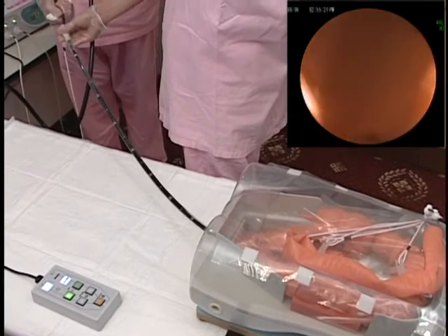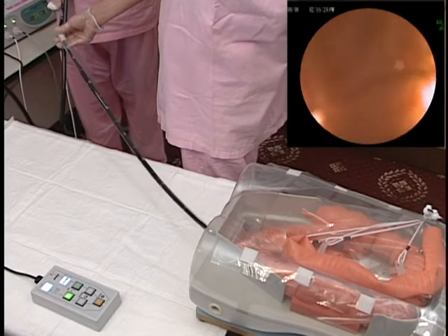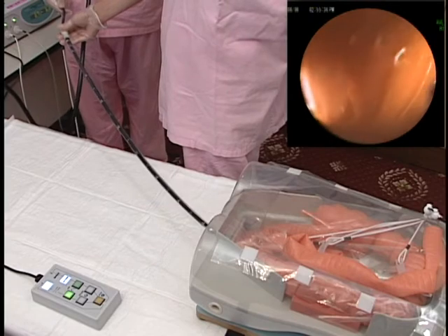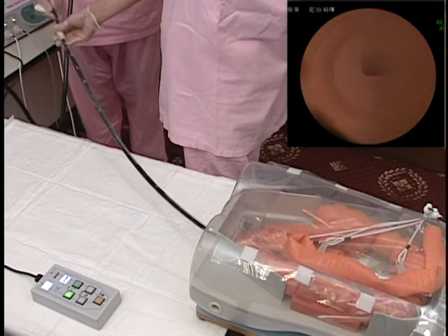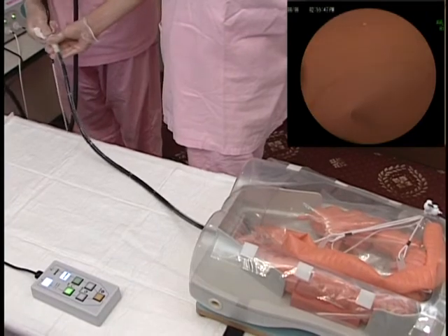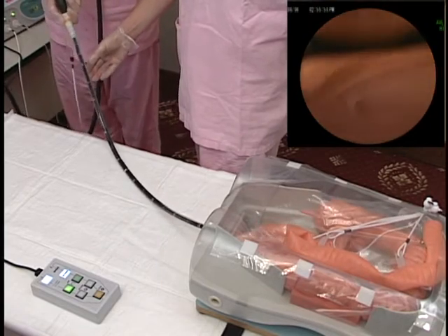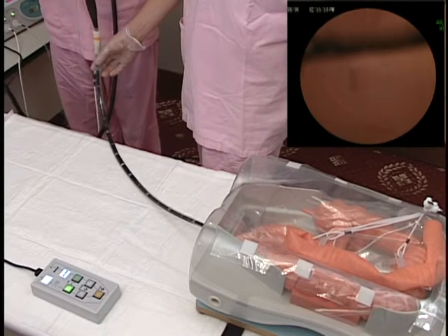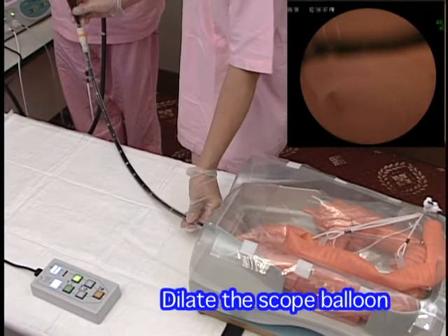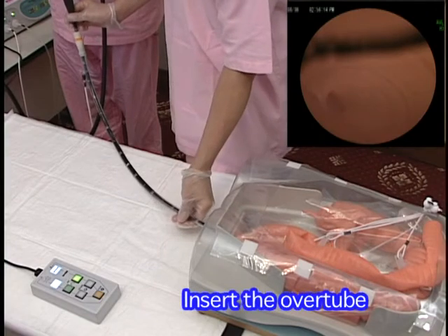Once beyond the iliocecal valve, advance the scope as far as possible into the small intestine. Inflate the scope balloon and hold the small intestine. After this, deflate the overtube balloon and insert it to align with the scope. At this time, make sure that the overtube balloon is sufficiently deflated.